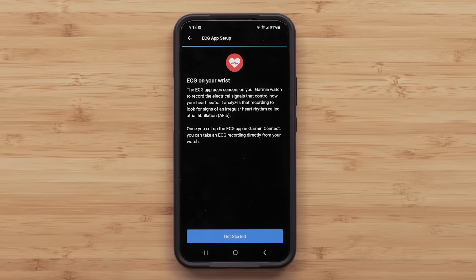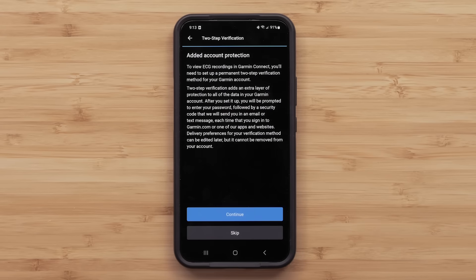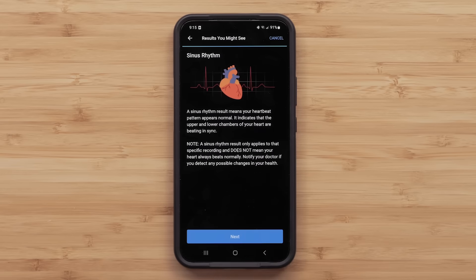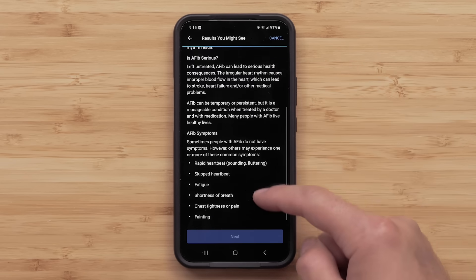Next, tap Get Started. To view your ECG recordings in Garmin Connect, you'll need to enable two-step verification. Follow the on-screen instructions to set up this feature. Next, read the information detailing how the ECG app works, the results you might see, and the important things to know.